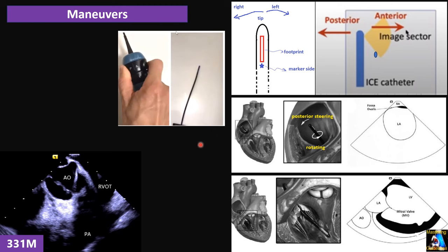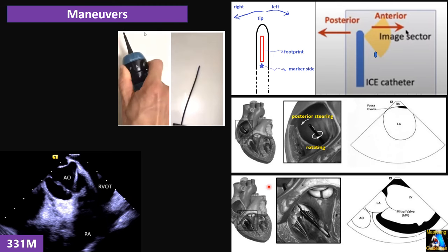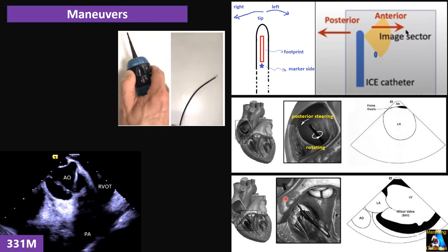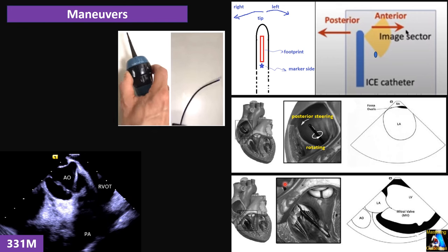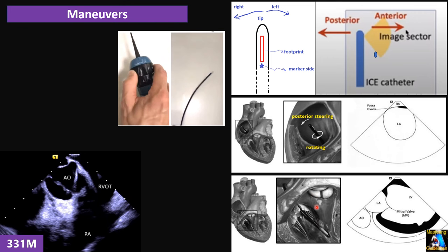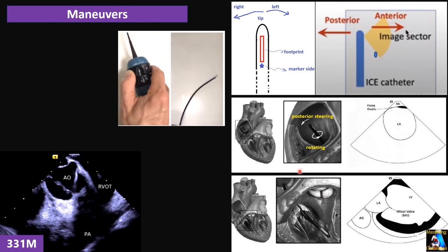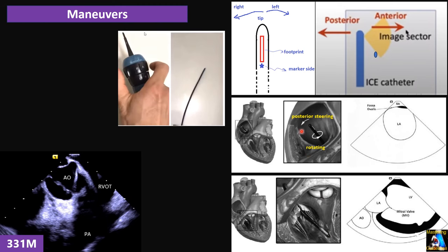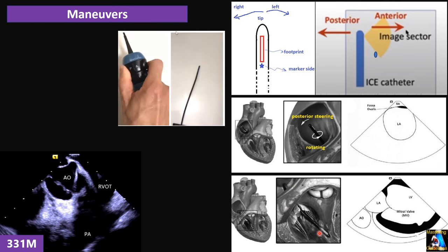Now let's go to the maneuvers. We have three movement maneuvers and four steering maneuvers. Let's go first to the movement maneuvers. One of them, like TEE, is pushing forward or advancing. For example, here the tip of the probe is in the right atrium. If we want to advance, we bend, and then we go forward.